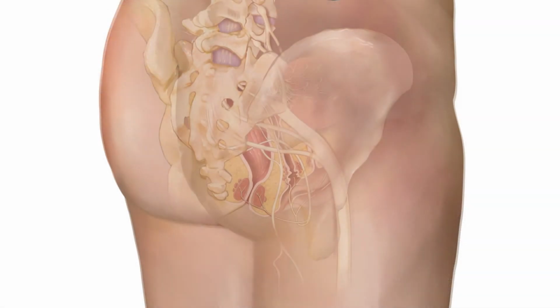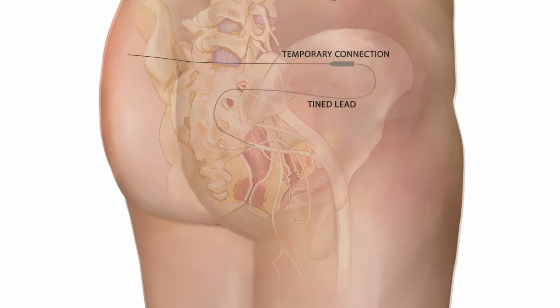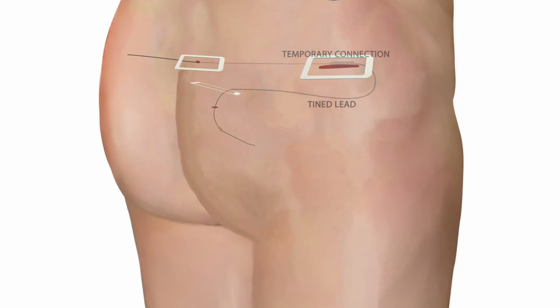Now, like I said, typically it's done under sedation, and it's not that different from the other procedure. The only difference is we actually tunnel the wire to where the generator will be placed at a later date, and then place a temporary wire out the other side of your back to provide a long distance to prevent infection from being able to get all the way to where the generator is located in 1 week. These temporary wires then come out and are hooked up to your temporary generator to trial while at home. As you can see, these leads look a little bit different than the ones in the peripheral nerve evaluation. They just have these plastic little pieces on them that prevent them from being easily removed.